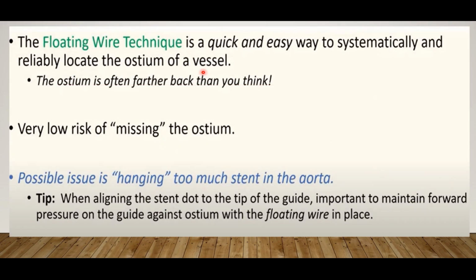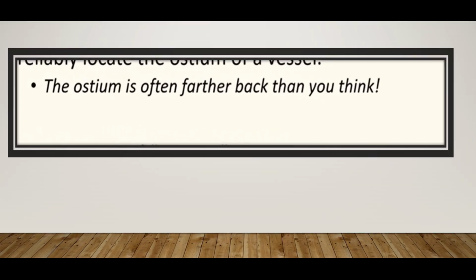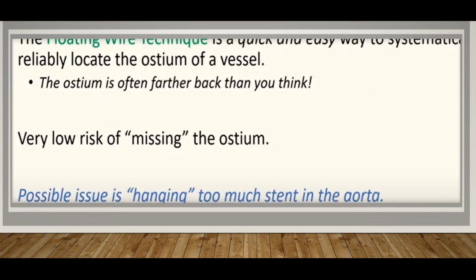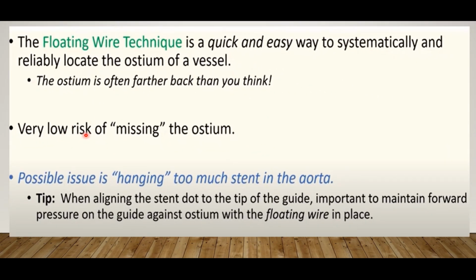So the floating wire technique is a quick and easy way. Don't forget that the ostium is often farther back than you think. There is very low risk of missing the ostium because you demarcate the real position of the ostium and you know the location.